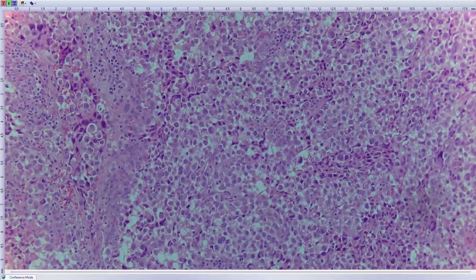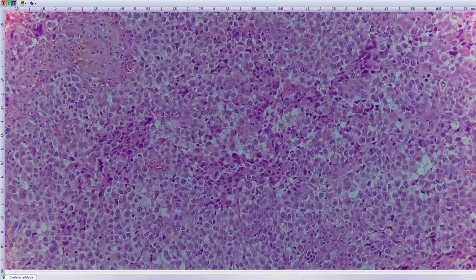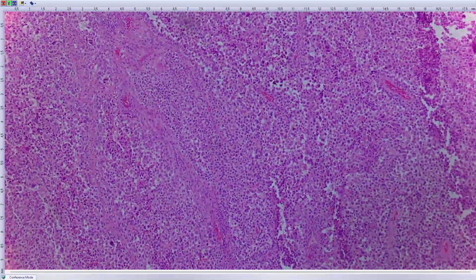But when you look at the morphology and you think about the very aggressive clinical course and the frequency of various malignancies, there is definitely a top differential diagnosis, which is undifferentiated melanoma. You see these large round to rhabdoid cells with prominent nucleoli, a lot of mitotic activity, huge areas of necrosis. So by just seeing this, you should think about undifferentiated melanoma in a patient with a widespread disease. And indeed, when I looked in the documents of the patient, she had a melanoma signed out 8 years prior to this biopsy. So even though S100, SOX10, all the melanoma markers are negative, with this history in the patient, you can with very high likelihood say this is undifferentiated metastatic melanoma.